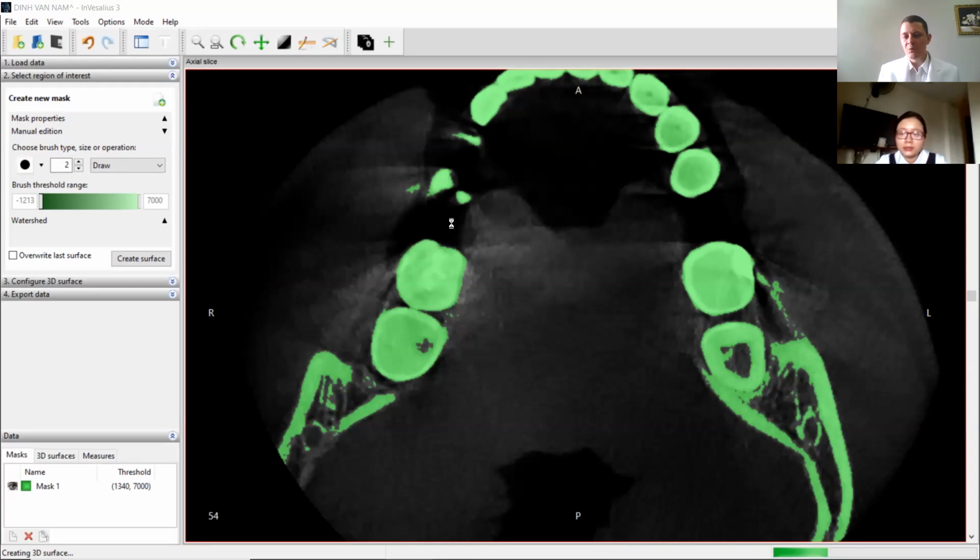So you will have to work with 3D files. Oh yes, standard also here. You will have to work with 3D files. Just in Vietnam, not so much yet because you don't have a scanner, but it will come very fast. Thì mình sẽ cần phải học cách xử lý những cái file 3D, tại vì hiện tại ở Việt Nam chưa có nhiều, nhưng mà tương lai thì nó có nhiều. Tại vì mình chưa có nhiều cái máy scan 3D, nhưng mà tương lai thì sẽ nhiều.